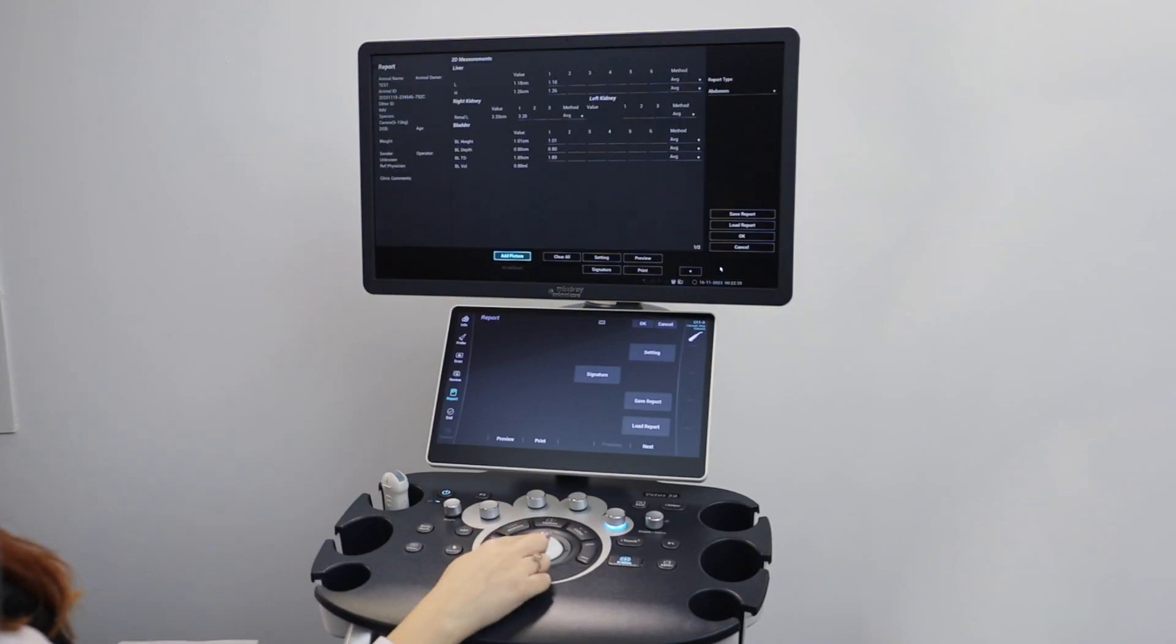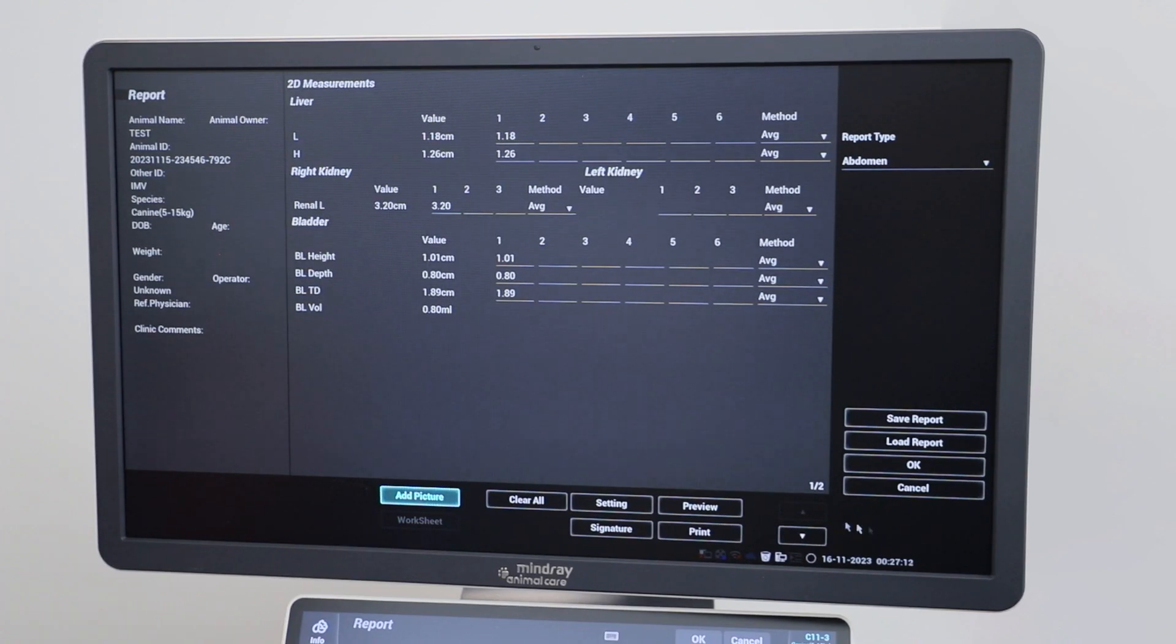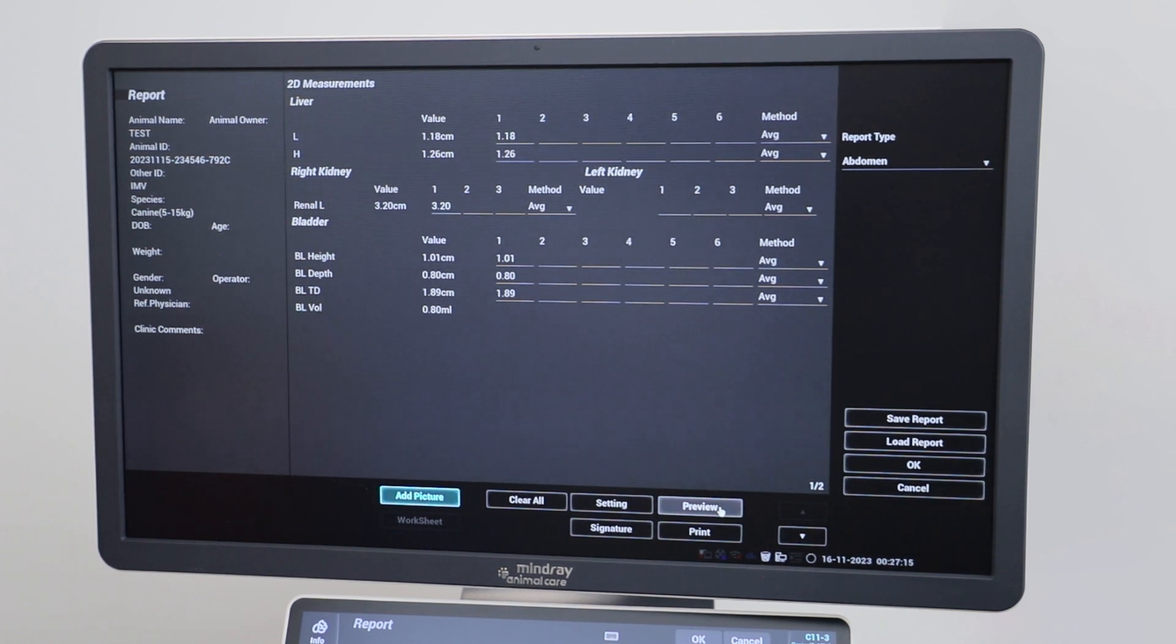Click on the preview button to view your report. This can be exported with your images after you have ended your exam.